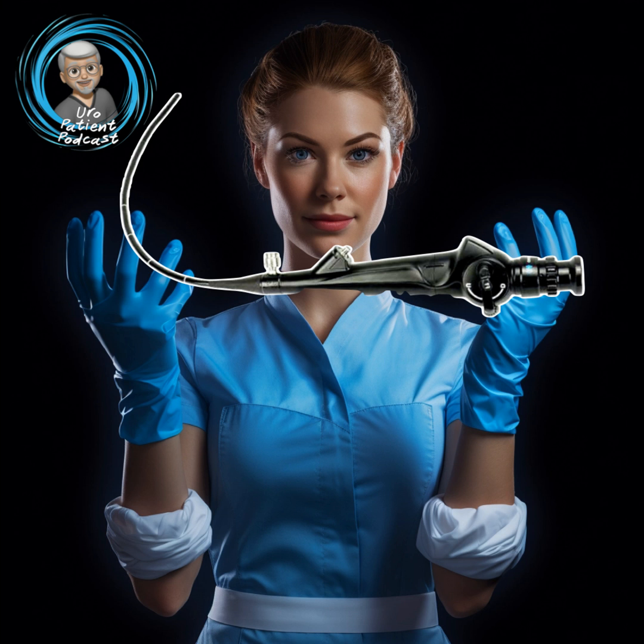Here's an example of that flexible scope being used. Most of the time nowadays, these are hooked up to video scopes, so we can actually watch on a monitor. Patients, as you can see, this guy is just watching his cystoscopy going on — it kind of takes your mind off of things, and it's interesting to watch. Most urologists prefer the video scope so they don't have to have their face right up against the scope, though sometimes we still go back to the old scope system depending on what we need to do.